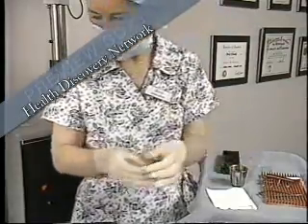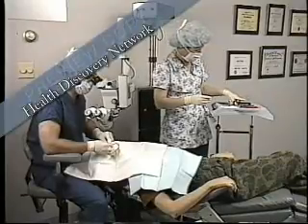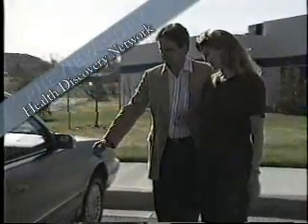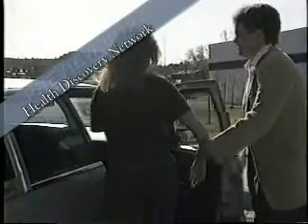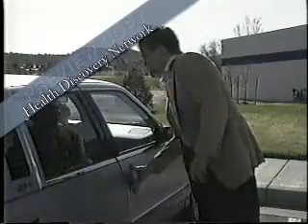Depending on your age, sex, and the amount of nearsightedness to be corrected, your doctor will make from 3 to 16 microscopic incisions in your cornea. The procedure itself will take only a few minutes. After the surgery, you may or may not be asked to wear an eye patch for a while. In either case, plan to have someone drive you home.